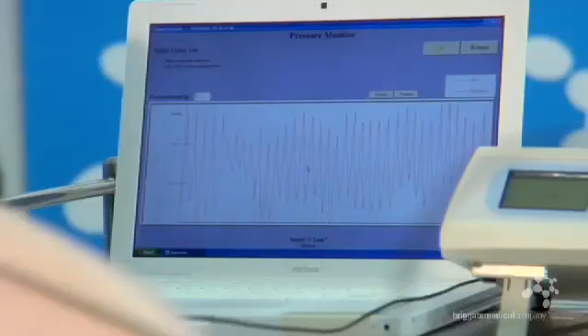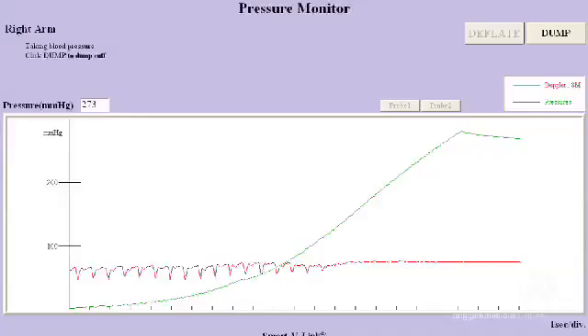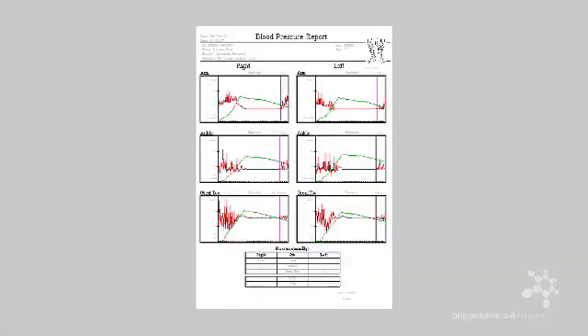Turning the volume off is especially important as the pulse shall disappear during cuff inflation and this may cause patient anxiety. Once the machine is happy with the strength of the pickup and the patient is calm, simply start the inflation by pressing either the probe button, the inflate button on the Doppler, or the screen icon, and continue to observe the patient throughout the process. Once the pressure is gathered and stored, a TBI figure will be calculated and presented.